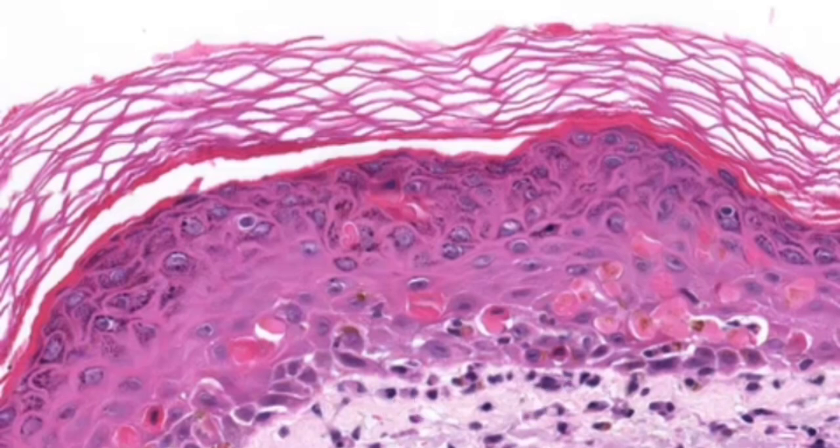Many consider Erythema multiforme to be essentially along a spectrum with toxic epidermal necrolysis. As one might expect, as the number of apoptotic or dyskeratotic cells tends to accumulate, you can have separation of the epidermis from the dermis with the formation of a subepidermal blister and eventual necrosis of the entire epidermis, which would be something more characteristic of toxic epidermal necrolysis.